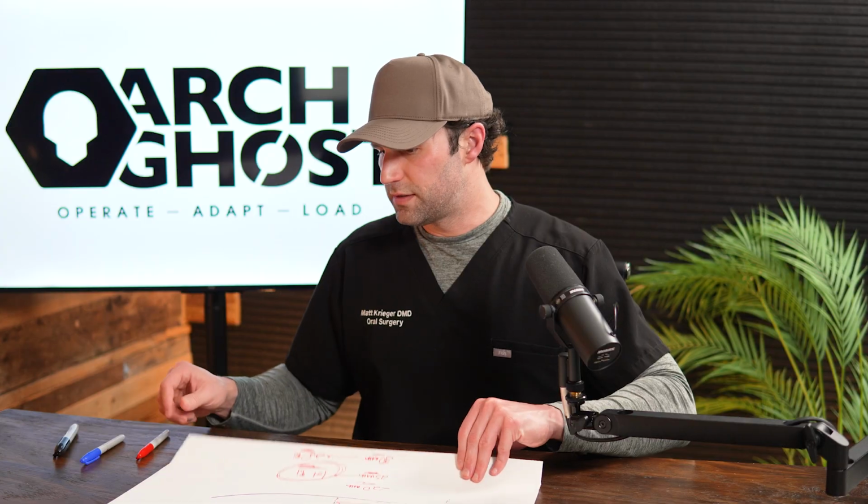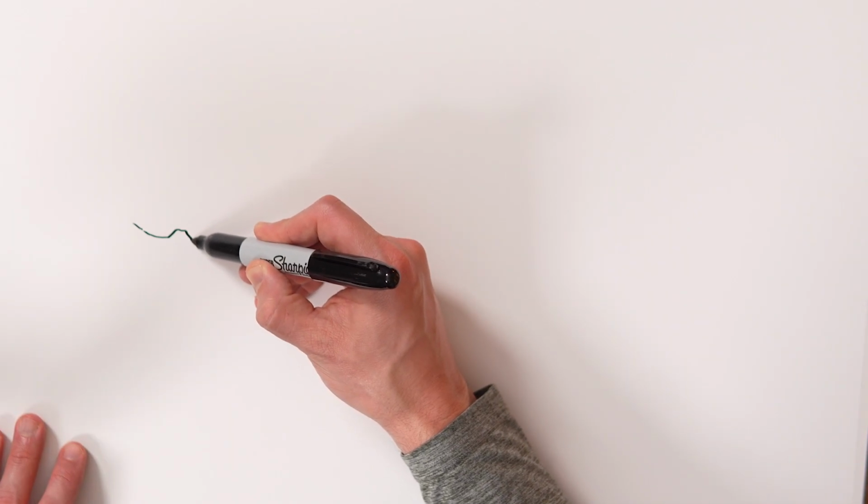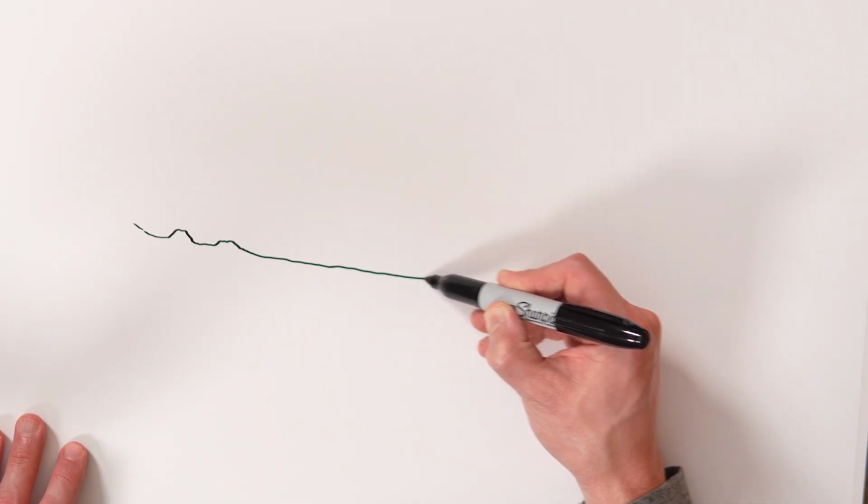Now, let's take a look at the second ID point, which is a socket or a defect. Now, this to me seems obvious, but many people don't use these as identification points. It's like the lowest hanging fruit out there for planning a case. So paying attention to where your sockets are and where defects are creates a huge advantage. So I'm going to draw that arch again. Let's say this side has a little bit of a defect, maybe a couple defects there.